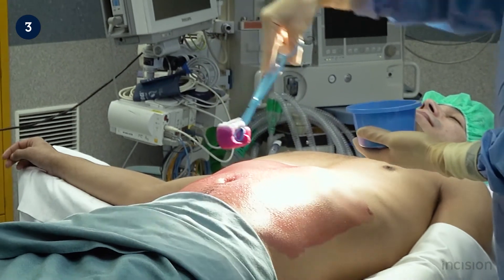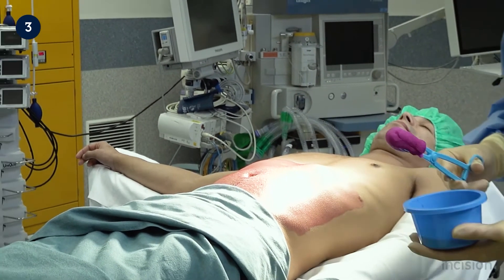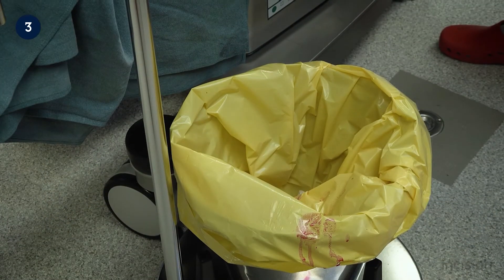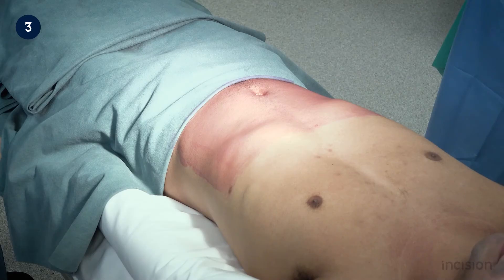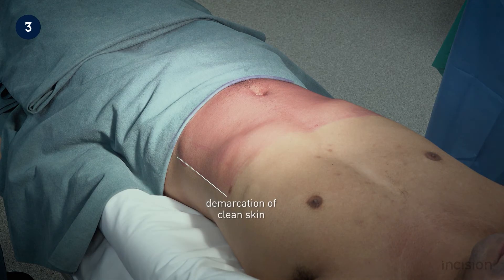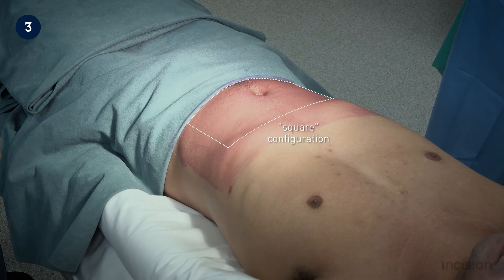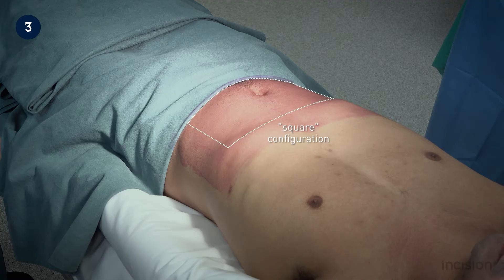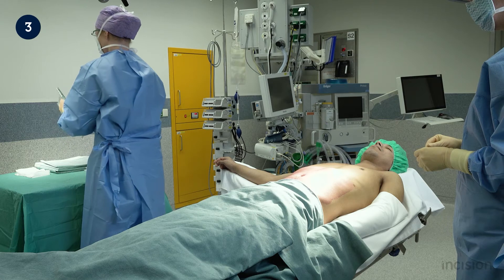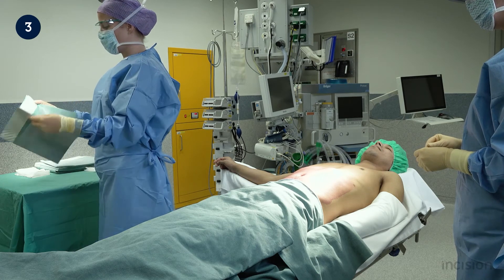With skin disinfection concluded, the swab is disposed in the bin, while the clamp and container are handed to the circulating nurse. For this midline incision of the abdomen, a square draping configuration will be used. The tint in the cleaning solution clearly demarcates where the skin has been cleaned. The square draping configuration therefore creates a more or less four-sided shape within the clean skin, a safe distance away from the not-clean skin. Drapes are now used to build a sterile field around this shape.